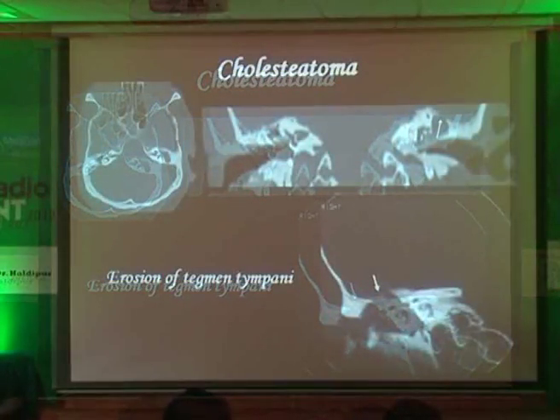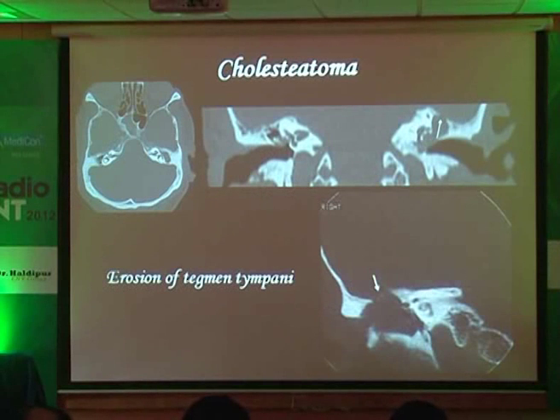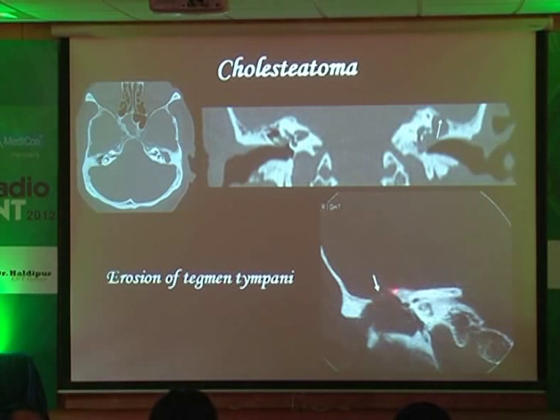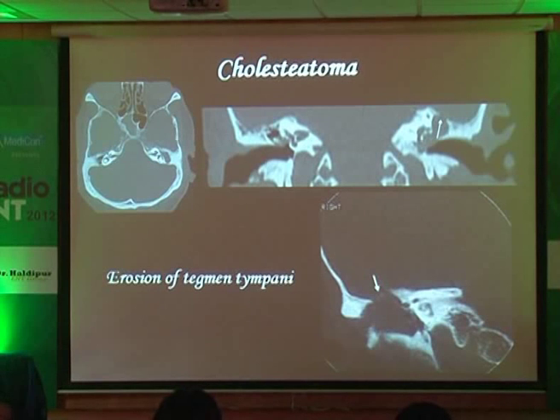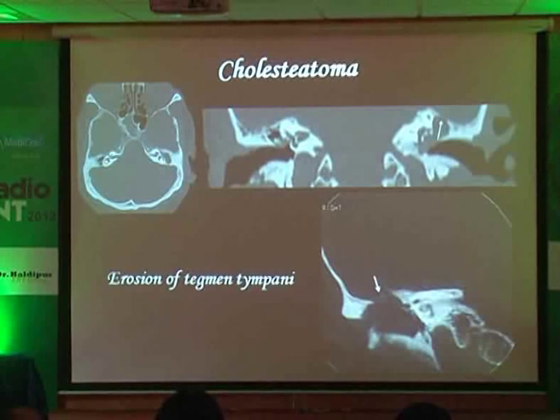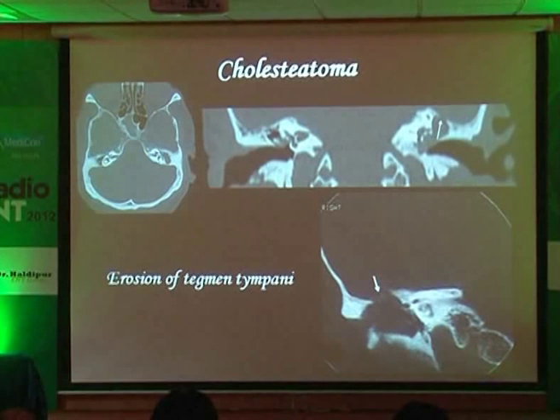Now moving on to tegmen erosion. This is the erosion of the tegmen by cholesteatoma. You can also have a large defect within the tegmen. This provides the axis for intracranial extension — there are two areas: one is the tegmen, and the second is the dural plate from where you can have intracranial extension.